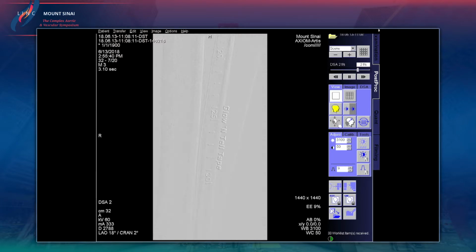So if a wire is leaning on the medial side of the vessel, if you start cutting that medial side, you're going to be moving further and further away from that lateral side. So you want to cut opposite your wire bias. Not really an issue here, I don't think.